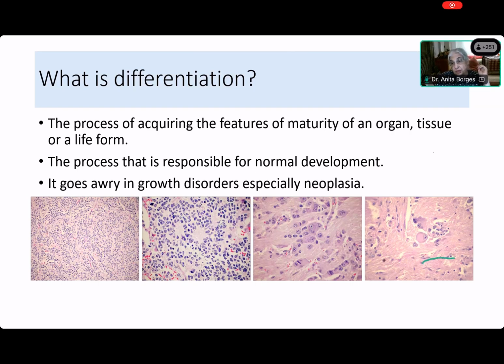Yes, there she is with her green pen. She has shown that there are spindle cells. So yes, you're right. So this is not anything to do with mucin. So you've got a cell. Now let me just take my pen and do this. Look at this cell. Everybody can see this, or maybe the white is not such a good idea. Let me take a green or something else. What cell do you think this looks like? Deepak? What does it look like? Ganglion cell. Very good. So we had a ganglion cell over there, and we had some spindle cells in this last picture.